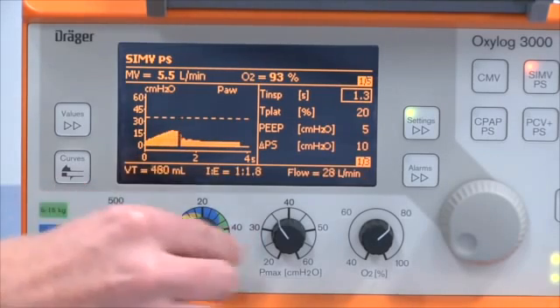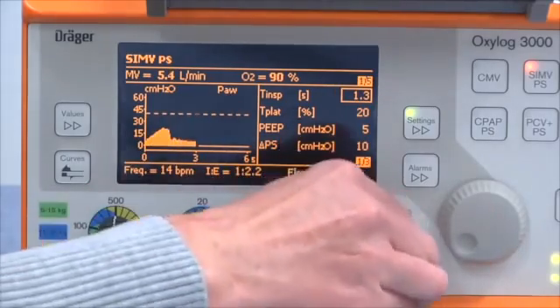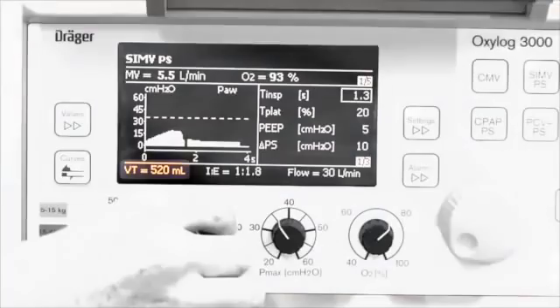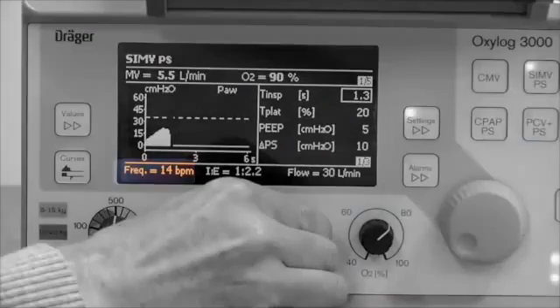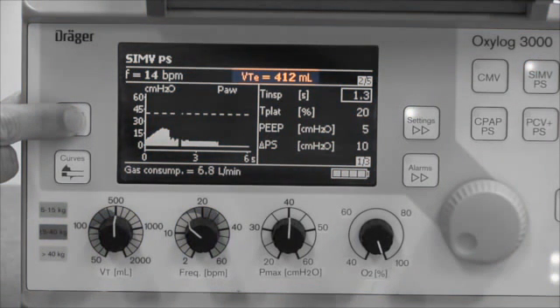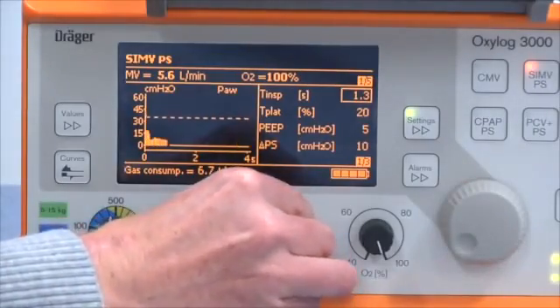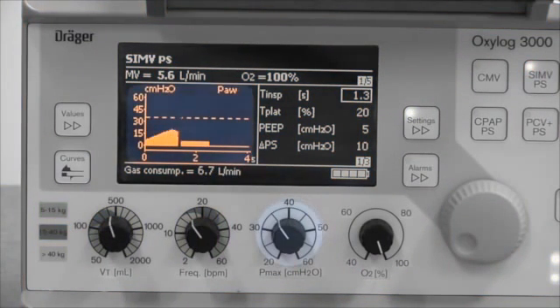Adjust tidal volume, rate, pressure limit, and FiO2 with the rotary parameter controls. As you adjust these controls you'll see the numerical values displayed in the information window. Now check the measured values, and in particular the expired tidal volume in the measured values window. Expired tidal volume often differs from the set value — for instance if there's a cuff leak or if the pressure limit has been reached. Make sure that the pressure limit is both safe and well clear of the peak of the pressure curve. If the pressure limit is set too low, the tidal volume won't be delivered and the machine will alarm.